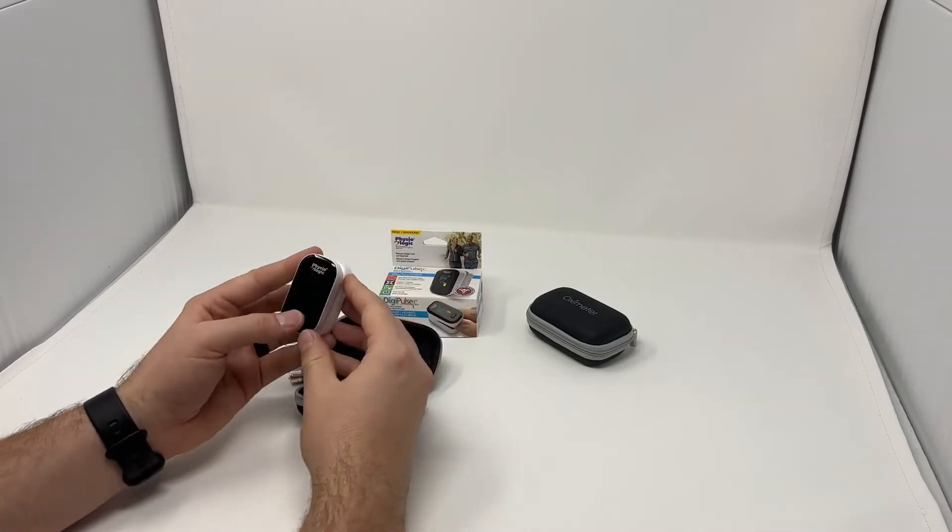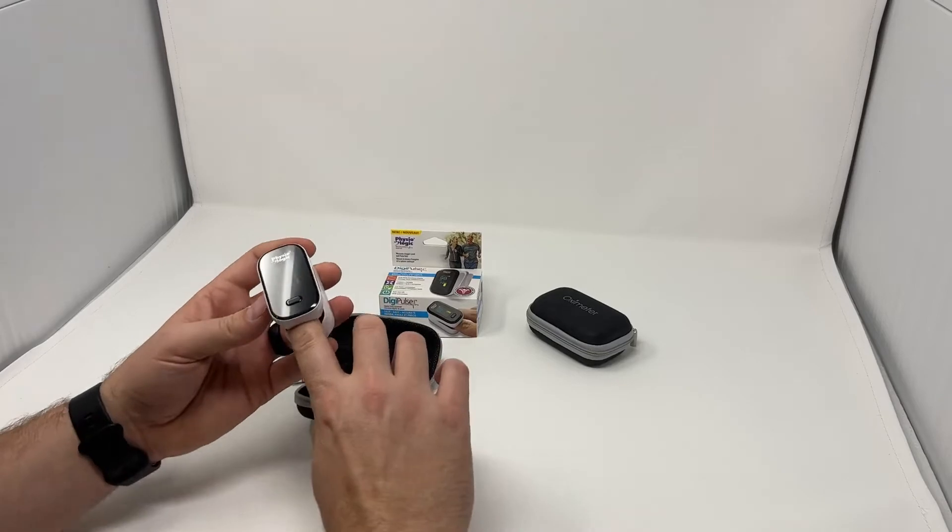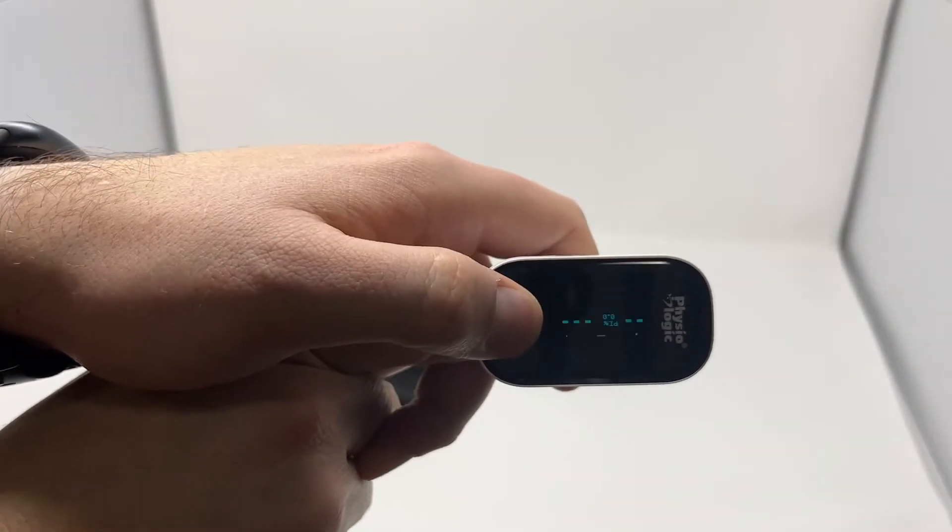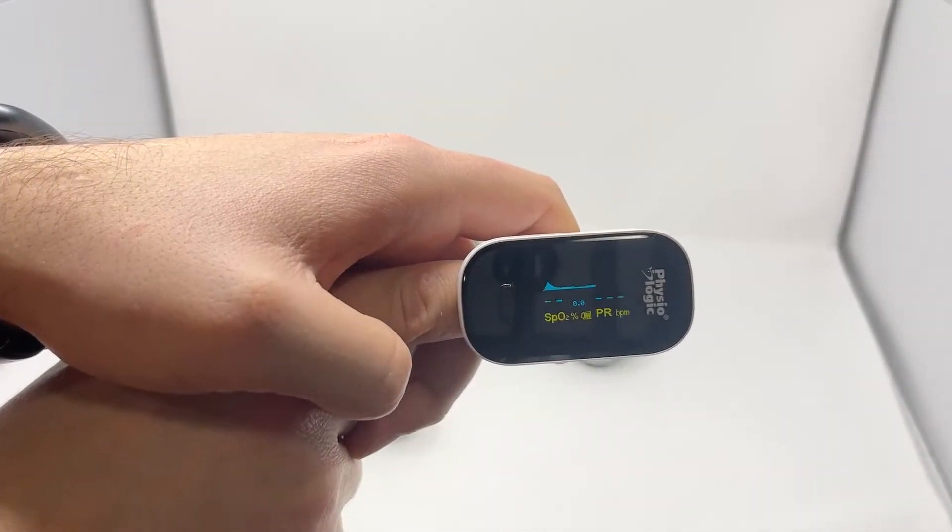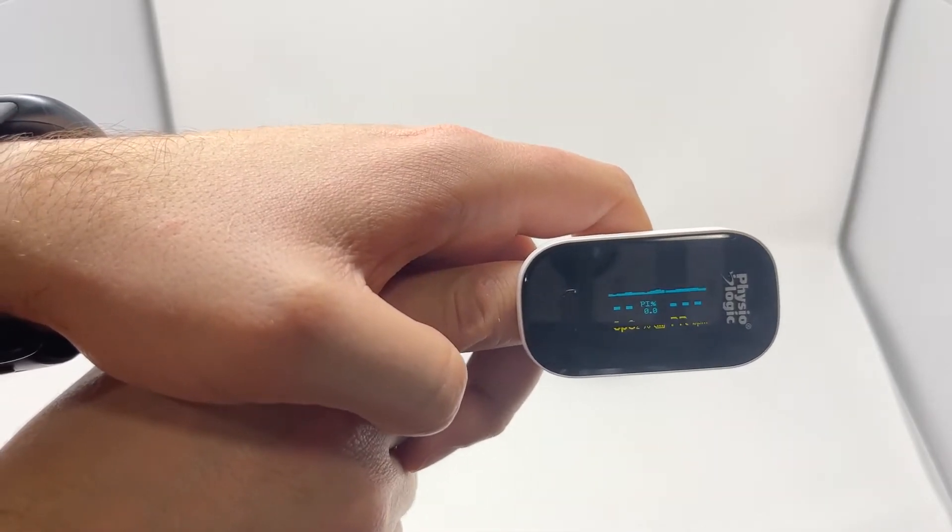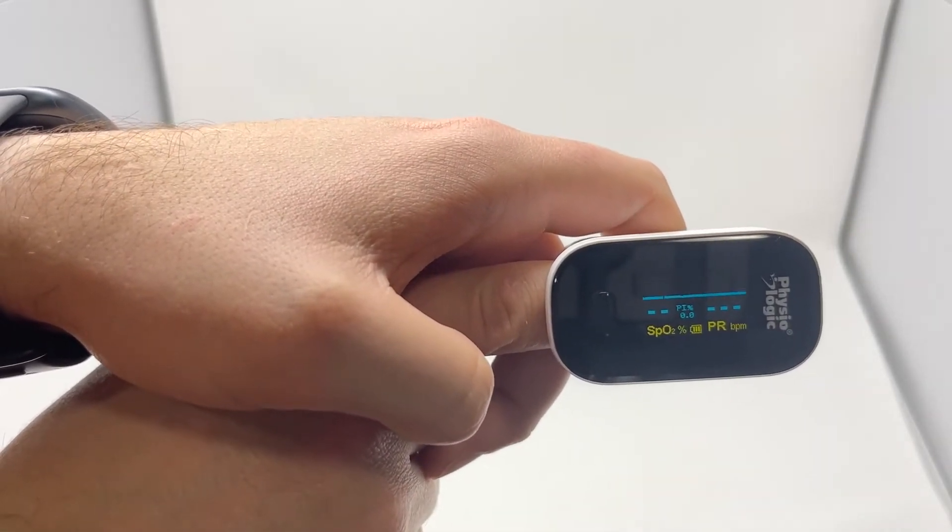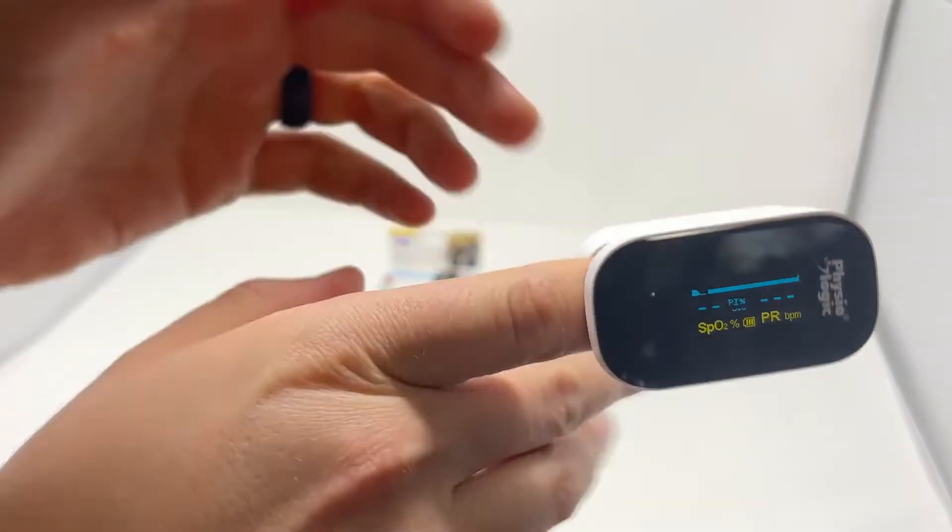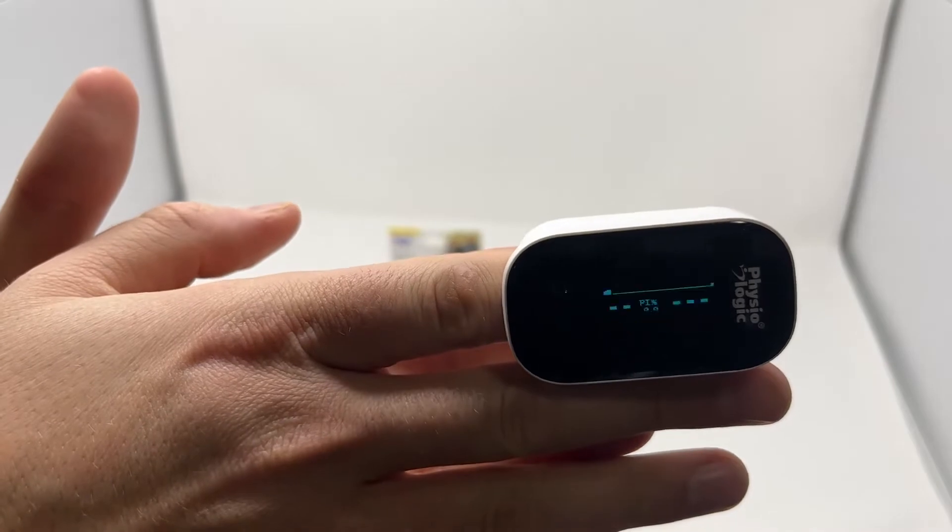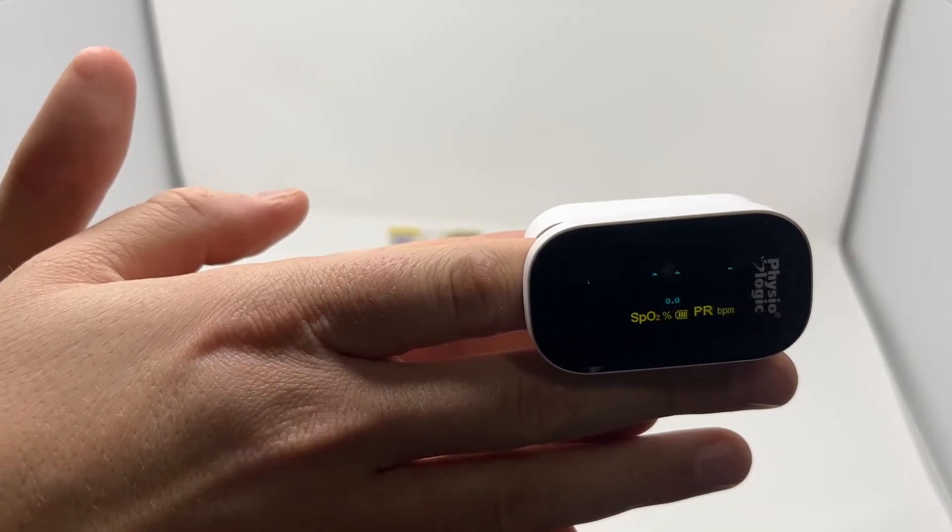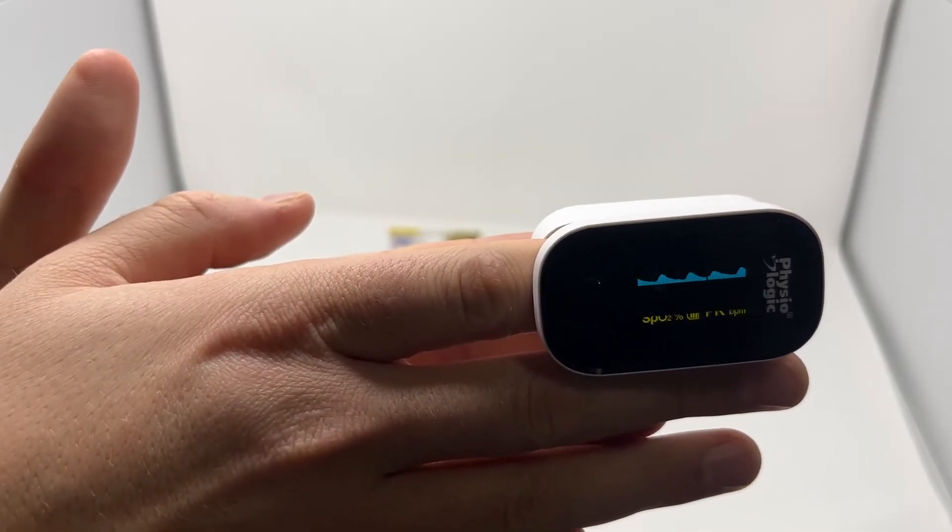Now these pulse oximeters show a number of readings. We'll just get this booted up so you can see. First of all, you're going to get the waveform on the top and that's going to tell you if this is reading well. Currently you've got that flat waveform - it's not getting a good reading. I'll try to get a better waveform here. There we go, now we're getting some peaks and valleys, getting a better reading there.